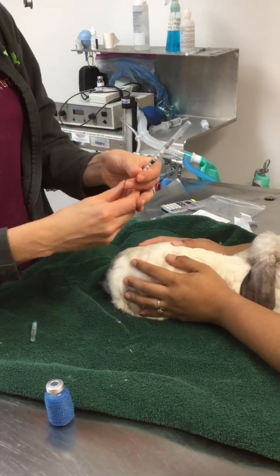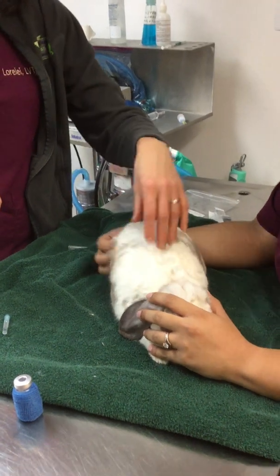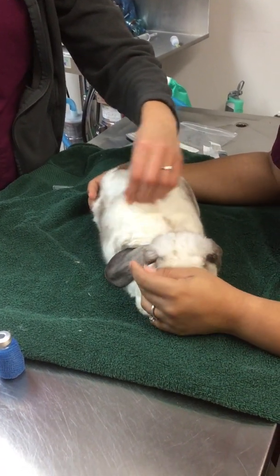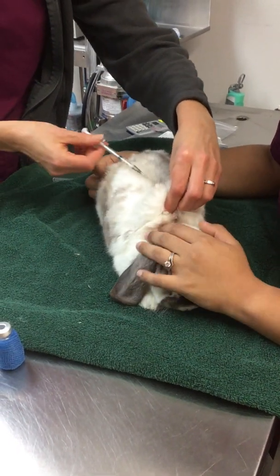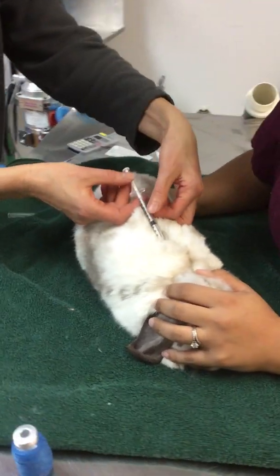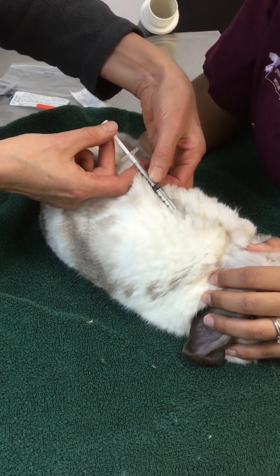I'm down to the 0.35 mils. I'm going to take off my syringe cap and I'm just going to make a tent in the skin right between the shoulder blades. Rabbits have all this nice extra skin in here and it really doesn't matter where exactly you go — it's anywhere in this area. I'm going to make a tent and I'm literally just going to pop under the skin. How do I know I'm in right now? If I pull back on my syringe, you see how the black part of the needle here bounces back?